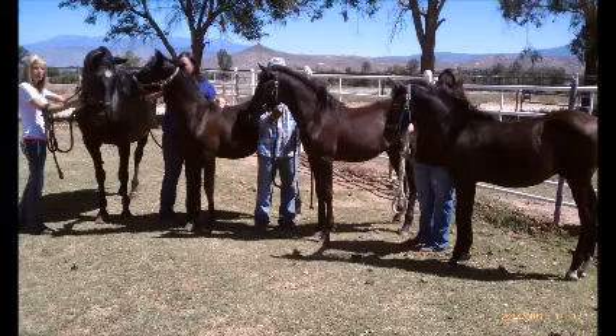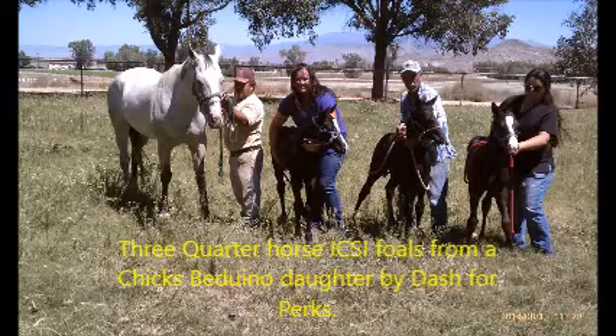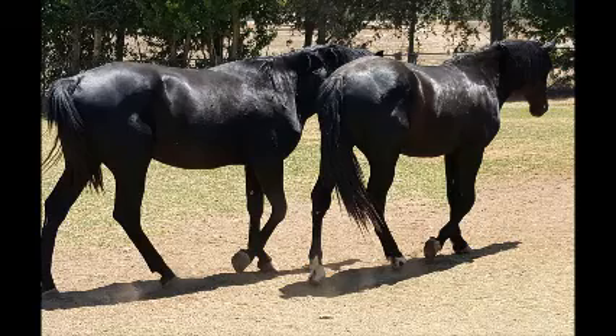We aspirated 25 follicles on both ovaries on this mare and ended up with 20 immature oocytes that we will place in maturation media. Once these are matured, we can expect about one out of every ten — or depending on the fertility of the mare, one out of every seven — of these to become an actual embryo.